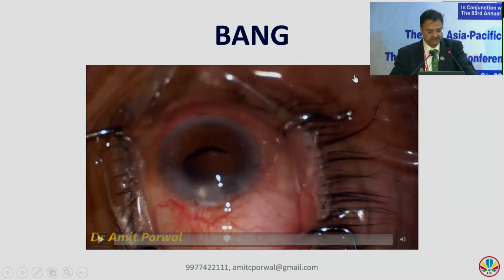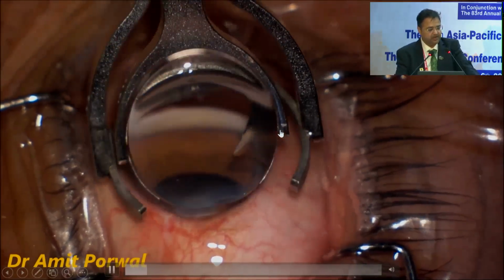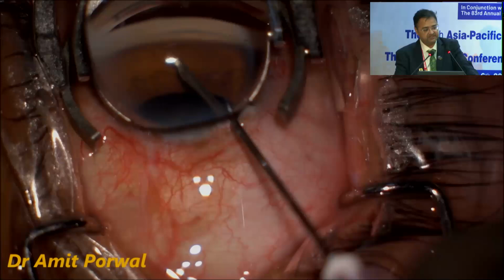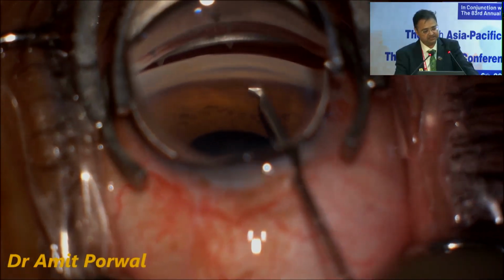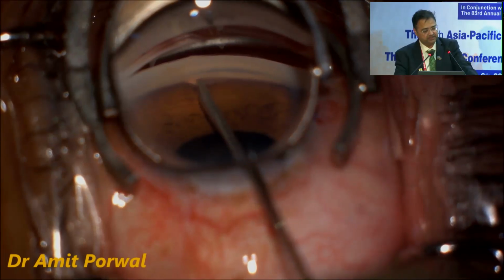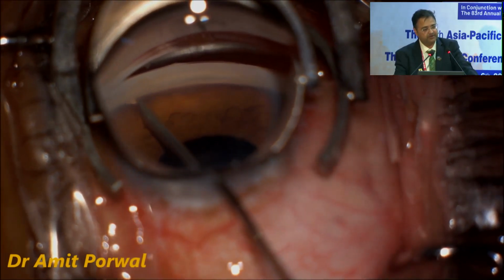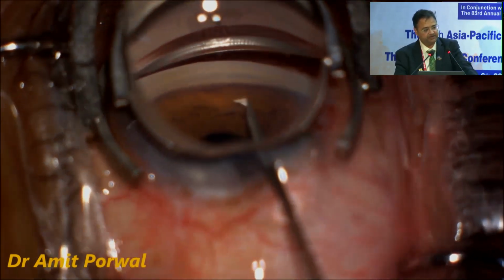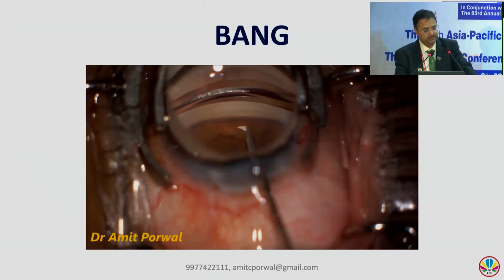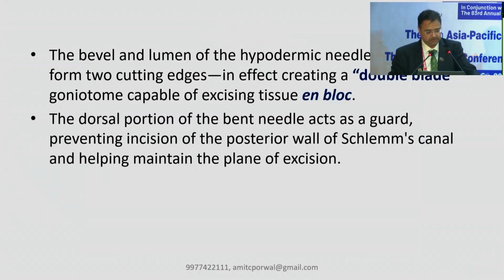So this is another case, once again showing the procedure. Ideally, we should always use a cohesive, never an HPMC, especially in the interface, because if you use HPMC, it just gets washed out, it flows down, and there can be blood. You should always make sure that the incision is more corneal and not limbal, because if it is limbal, then blood can come into the interface and obscure your view. So these are a few tips you have to take care of before you start the procedure so that your surgery becomes very smooth.